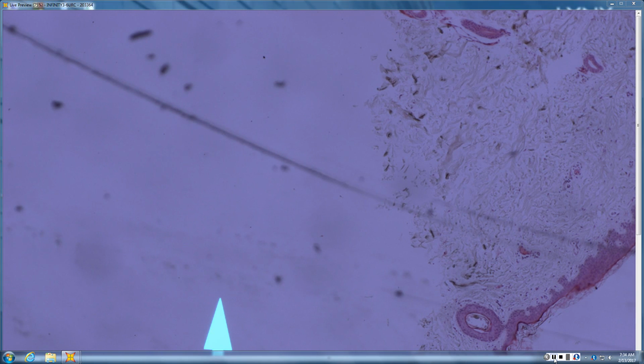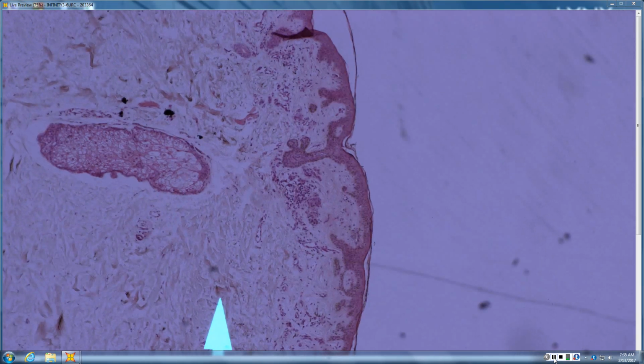Is that which one the worst prognosis? Those are usually bad. Yeah, they're usually bad melanomas. They're usually metastatic melanoma when it looks like that. So when you have a MET and you're trying to decide what that MET is, and you have rhabdoid cells, that's commonly melanoma.